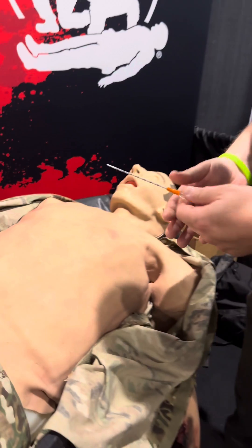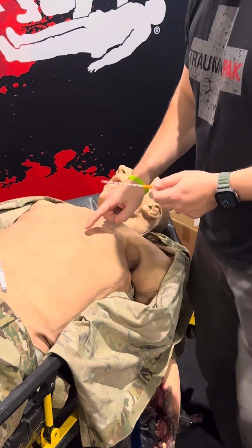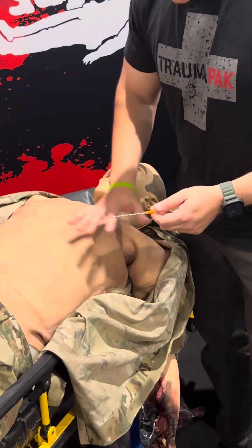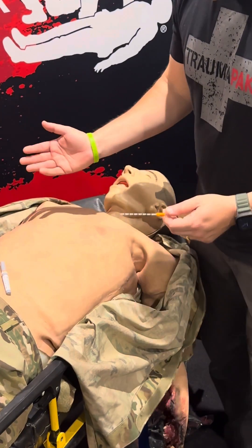Let's look at the procedure. We have our mannequin here. You can see unequal rise and fall of the chest — this one is not going up. A good technique is to do our MARCH assessment. We find that maybe there's a hole, and we've covered that with a vented chest seal.